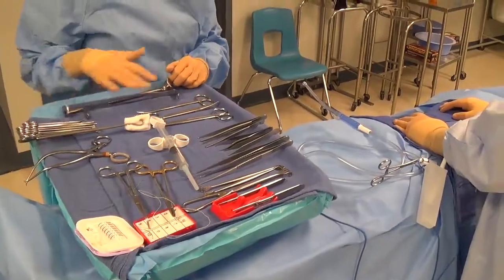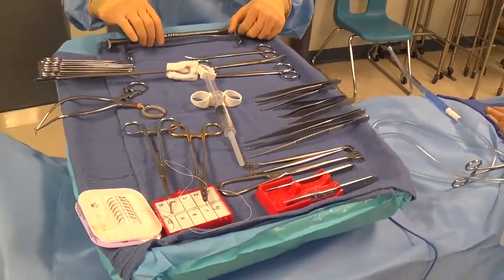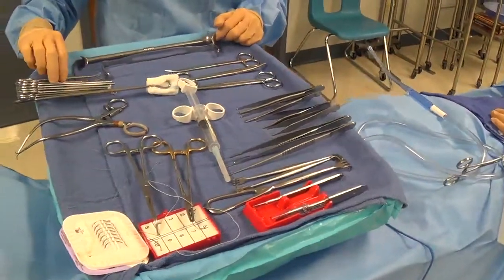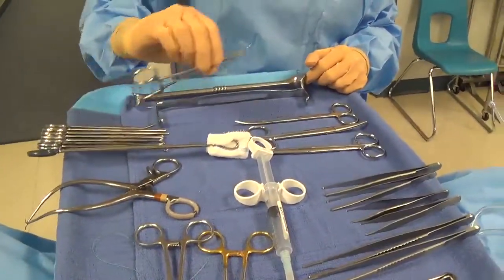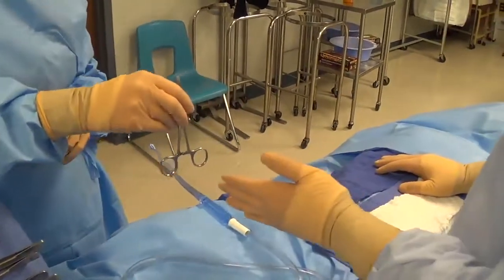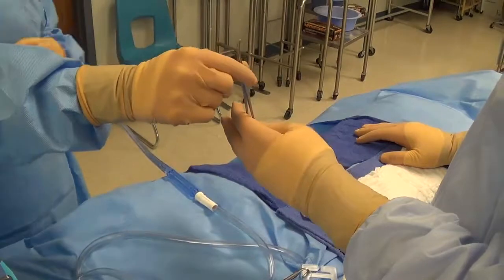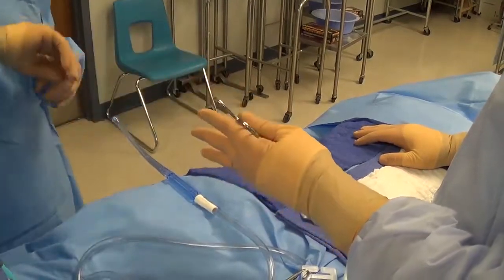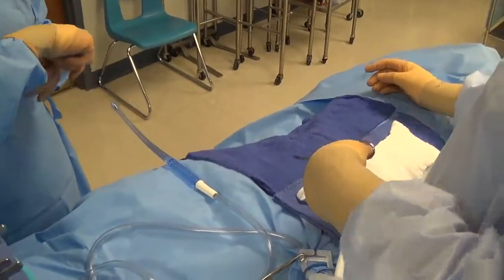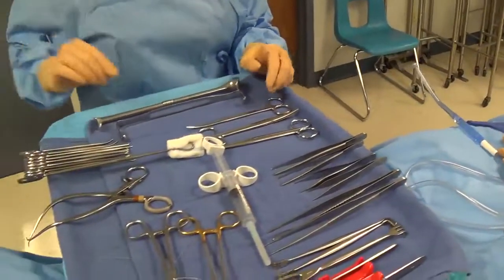This video is a description of how to hand basic surgical instruments and how to utilize proper safety precautions. First, some basics about how to hand instruments: when we hand instruments we really want to make sure that they're handed to function, which means the surgeon doesn't have to reposition it prior to using it. We never hand an instrument incorrectly, as the surgeon will have to reposition it, taking more time and decreasing the efficiency of the case.